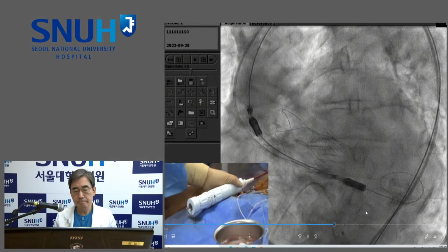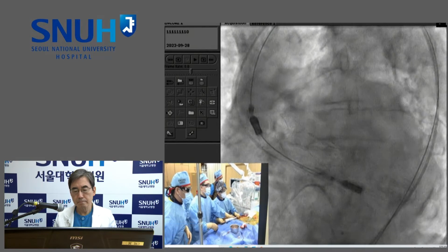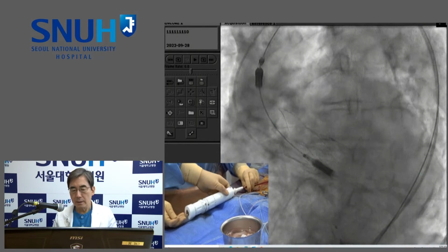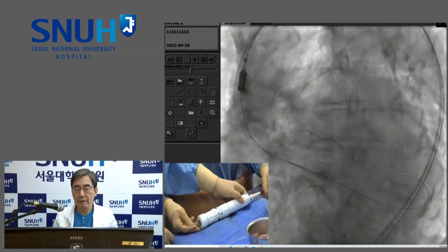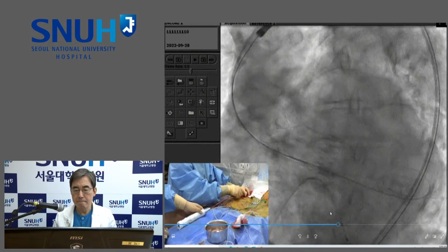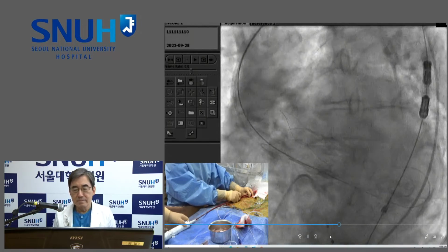But if the calcification is severe or the predilatation is not enough, there is some movement of markers over the valve and risk of embolization, and risk of suboptimal positioning. Thus, pre-ballooning is very critical for the process. So you don't like to recommend it for the bicuspid valve? Predilatation is not optimal, and not possible, in every case.